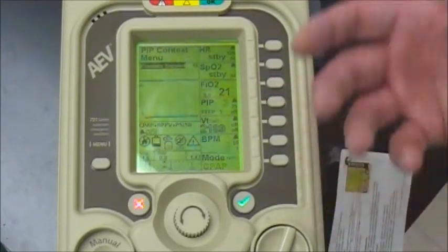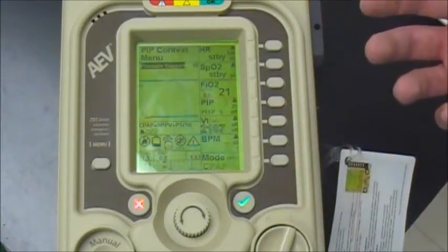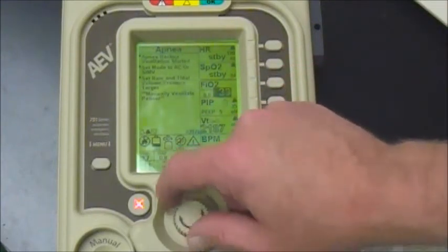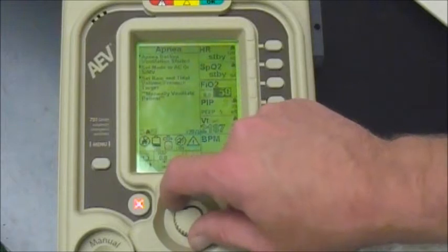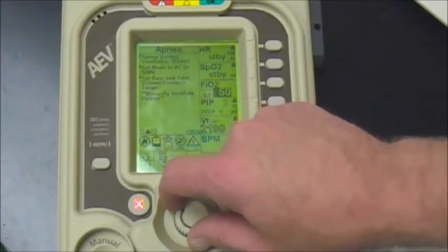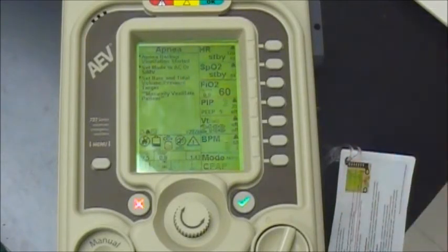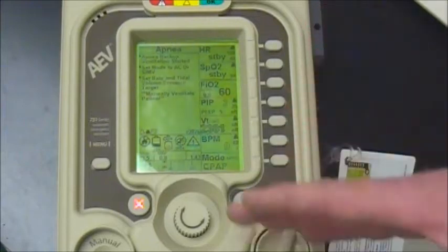We're watching for good, adequate chest rise, but not so much that we're at risk for barotrauma. Next, we can change the FiO2 up to 60, and this is going to be titrated in either direction to make sure our patient's SpO2 is somewhere between 94 and 99. If your patient's doing well with this, leave these settings — it should be fine.